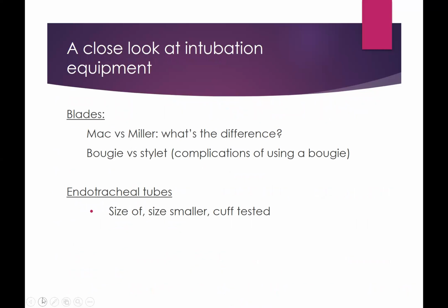So a little bit of a look at intubation equipment, and I'm actually not going to really go into intubation equipment in this talk, but these are just a few pieces of equipment that you're welcome to spend a little bit of time looking up on your own if you have interest in it. There are a couple different blades that are commonly used. We mostly use Mac blades. Where I work, I do know several anesthesiologists that really prefer the Miller blade, and there are reasons for that as well.